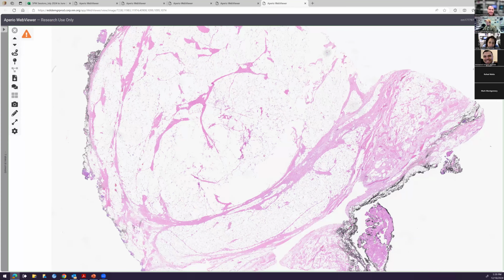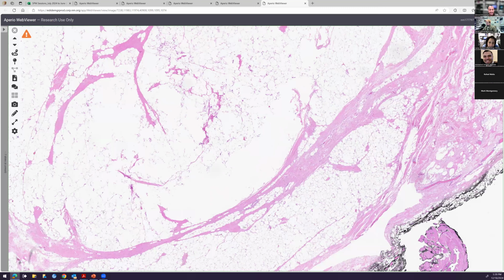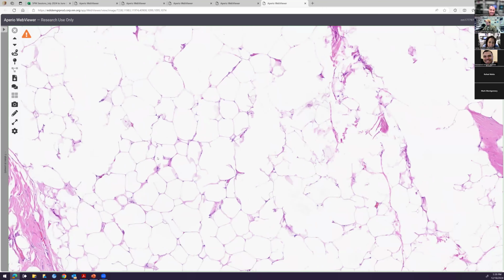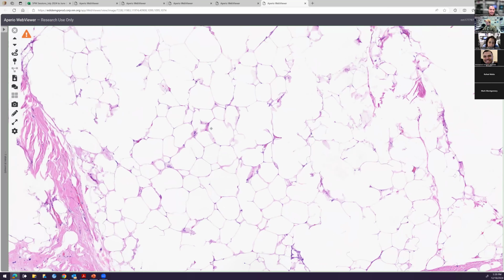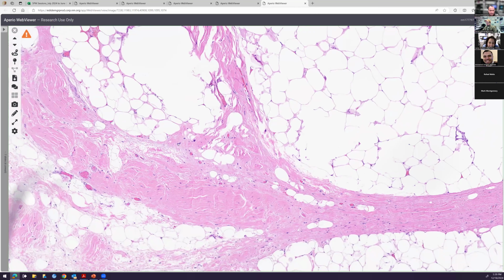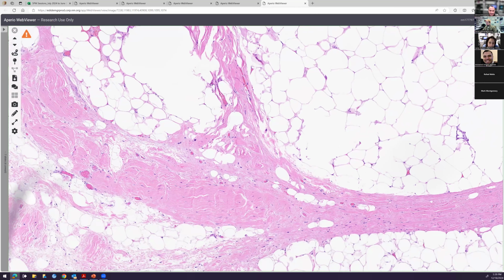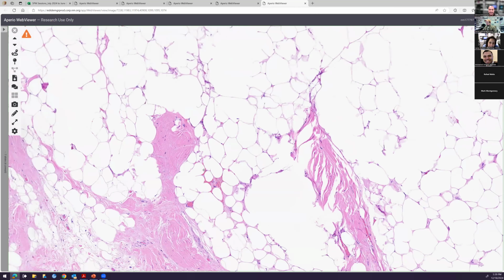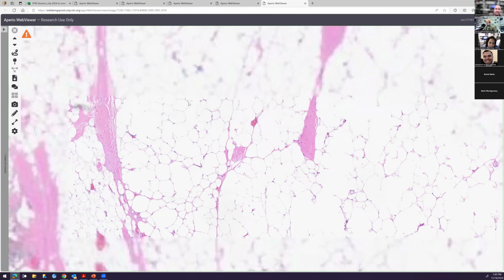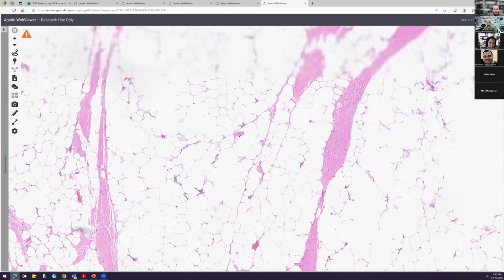We're looking at a lot of mature adipocytes, and very interesting fibrous septae. Kind of thick. All right. Screening at 4x. Somebody's screening at 4x. Has somebody stopped over here? Yes. Looks like we have some scattered atypical hyperchromatic cells. Yeah, exactly. Let me load this up a little bit.